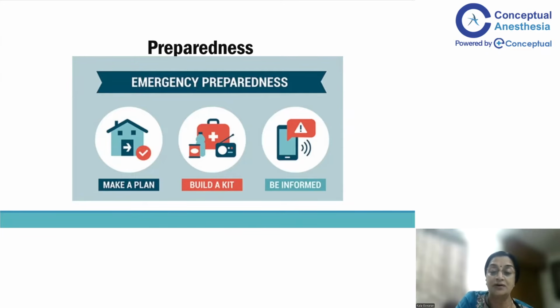So FONA is a very important step. You begin to do FONA right from the beginning in the PAC itself. And it's mostly for unanticipated, it comes as an emergency front of neck access. So for that, your drawer D or plan D drawer has to be always and always ready in your difficult airway crash cart.